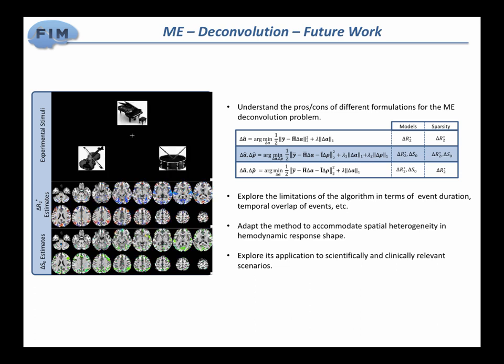But we think this is something that will allow you to look at your data in a less constrained manner, and hopefully this is helpful for things like naturalistic stimuli, resting state, and even the study of interictal events in epilepsy.